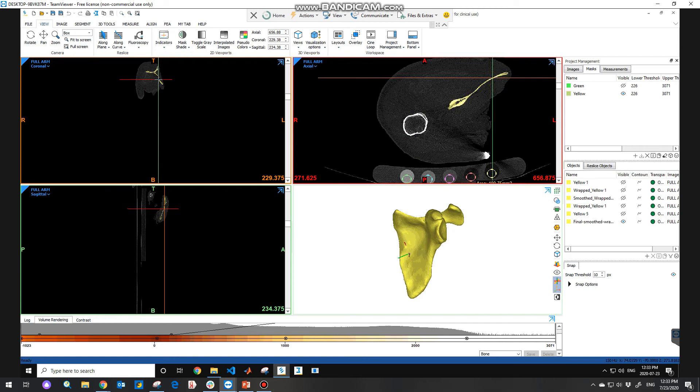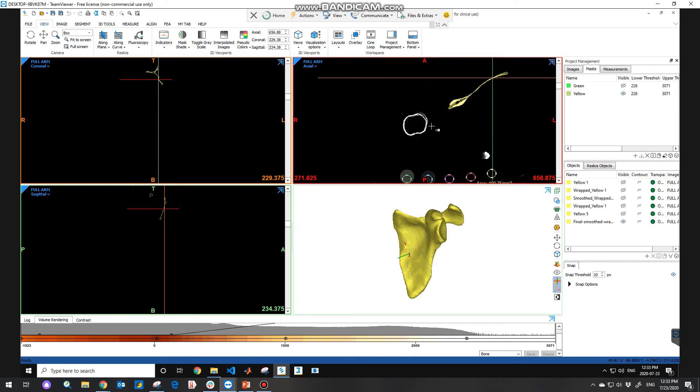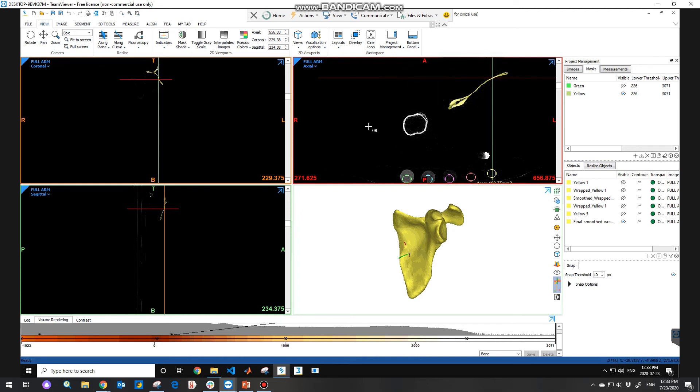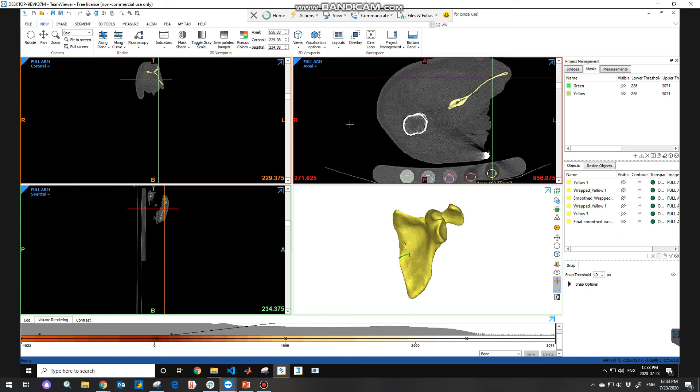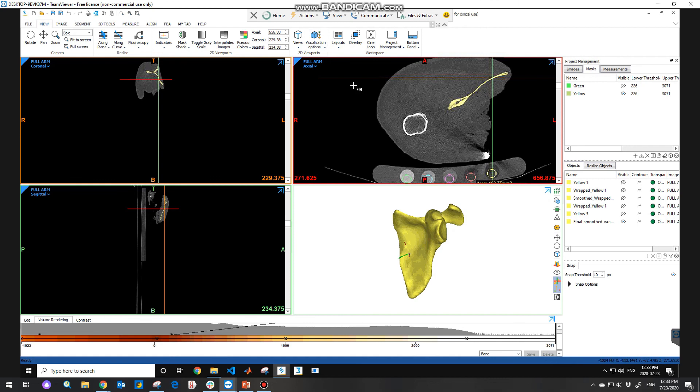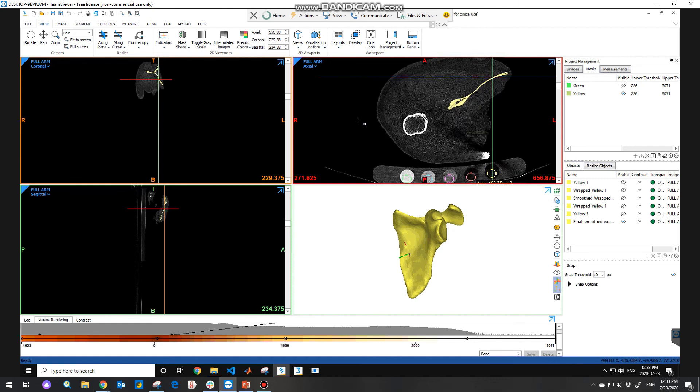You can also change the brightness by right clicking and dragging the point from left to right. Or the contrast by right clicking and dragging the point up and down.